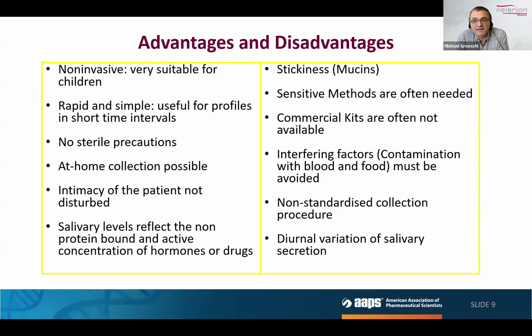Other disadvantages are also related to the physiology of saliva production. The often lower concentrations require very sensitive analytical methods. But fortunately, much has been achieved related to analytical sensitivity in recent years.